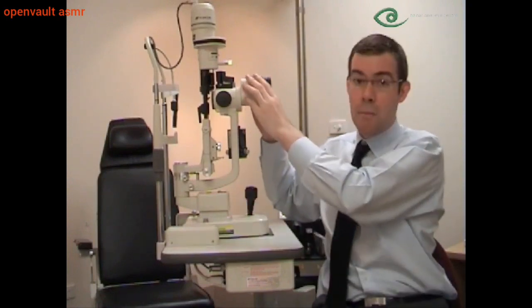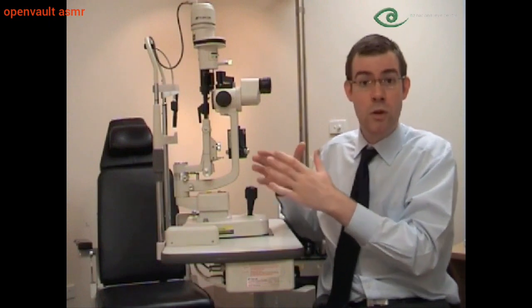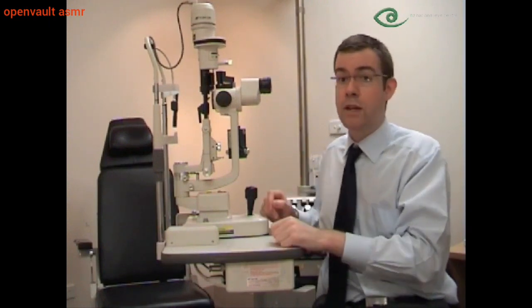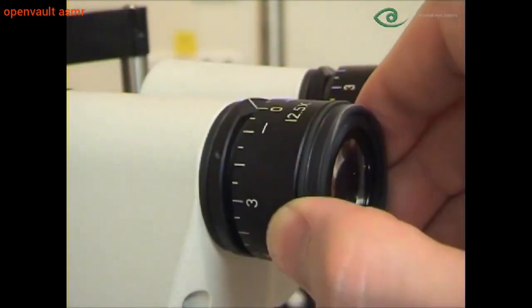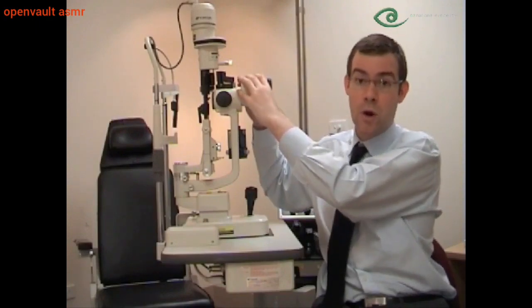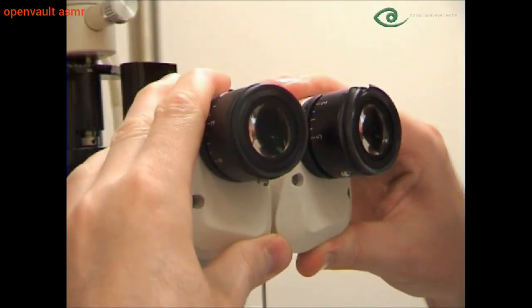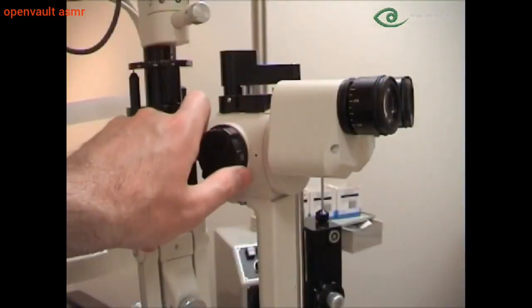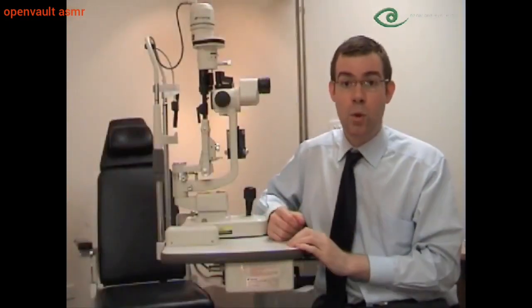The microscope is a binocular microscope. It has 2 eyepieces which converge, which give you a stereoscopic or 3-dimensional view. You can adjust for your own refractive error on each eyepiece by rotating the dial. Similarly, you can change the distance between the eyepieces to account for your own interpupillary distance by pulling them apart or pushing them together. You can adjust the magnification by rotating this dial. You want to start with a low magnification initially and then increase it at points of interest.